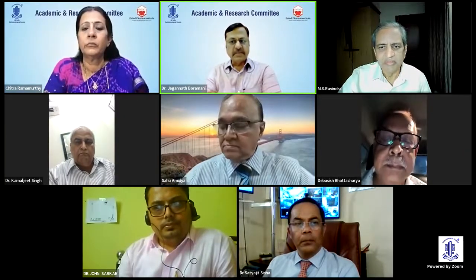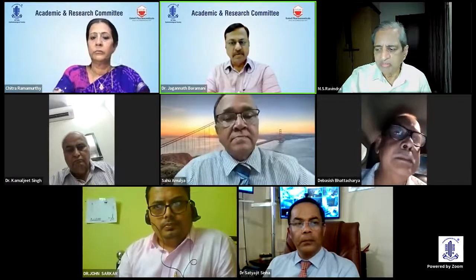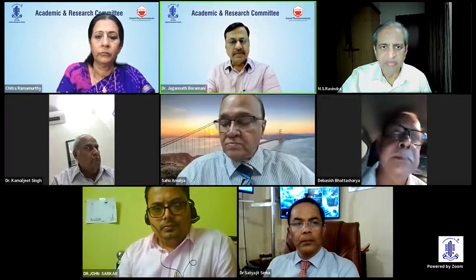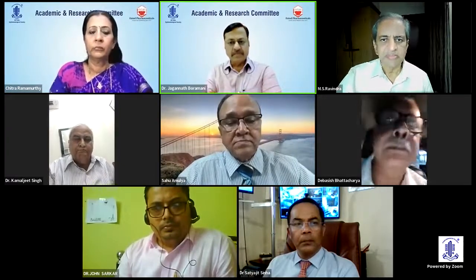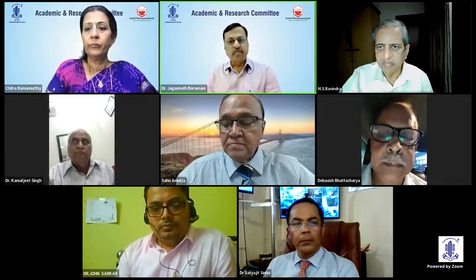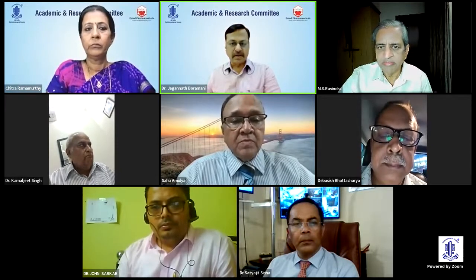And even if the teachers train their students, many times the teachers are reluctant because there is a manpower loss. One week the student will be away from the hospital. But if a beginner learns on the simulator, it saves a lot of time of the teachers in the training because they become almost partially expert in doing the human eye. So everyone should take the benefit of SICS simulator training.